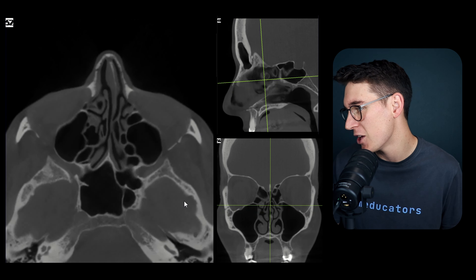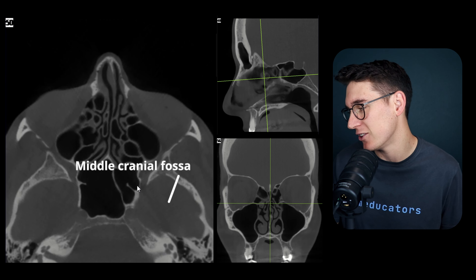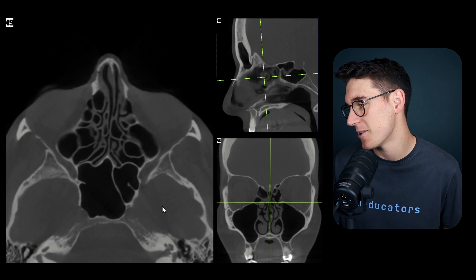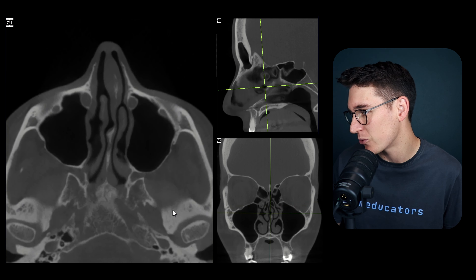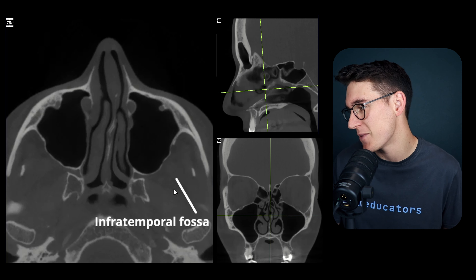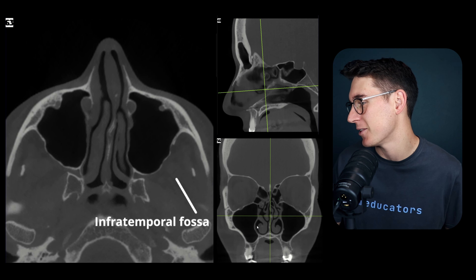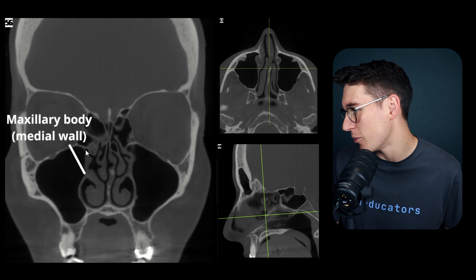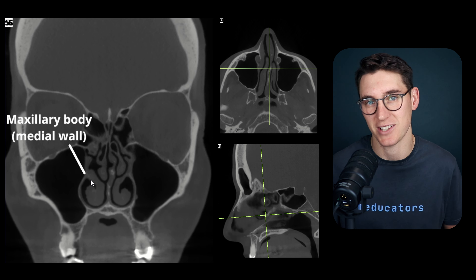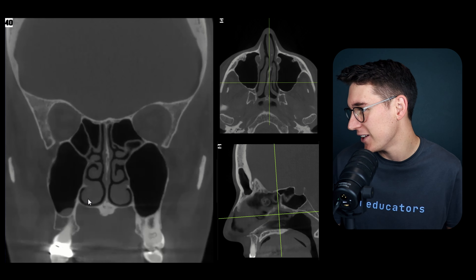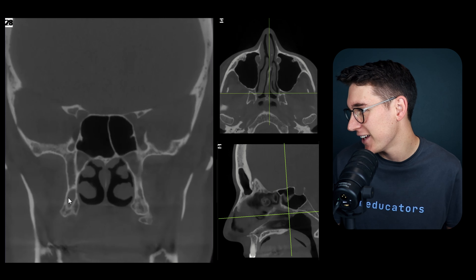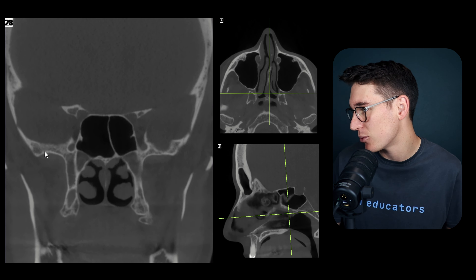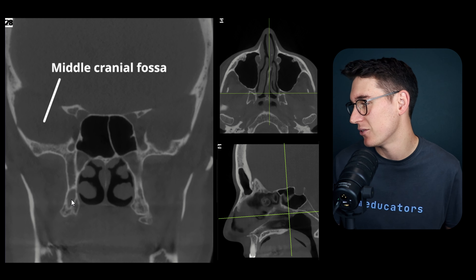If we scroll up superiorly we enter the middle cranial fossa where the temporal lobe lies. As we scroll down inferiorly we reach the infratemporal fossa - this is not intracranial, it lies underneath the cranium. On our coronal scan the medial walls of the body make up the lateral walls of the nasal cavity, and scrolling posteriorly we can see the infratemporal fossa behind the maxilla, with the temporal lobe within the middle cranial fossa above.